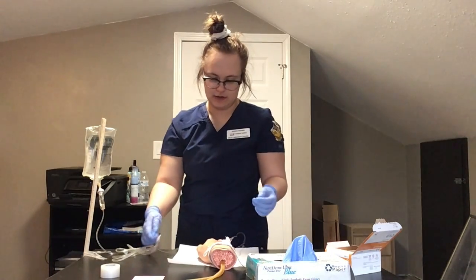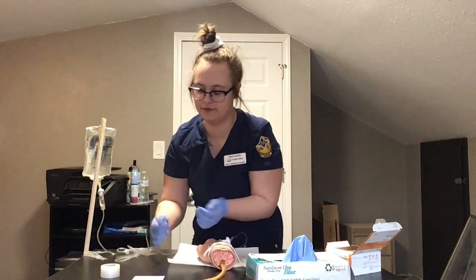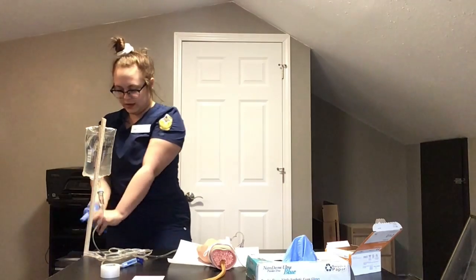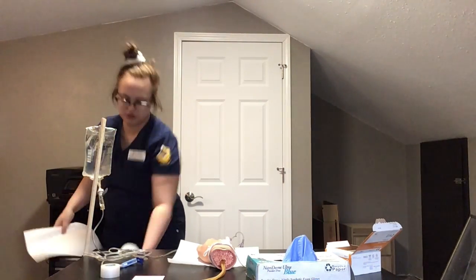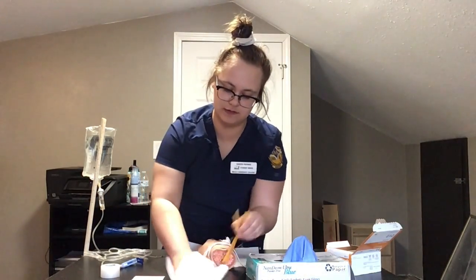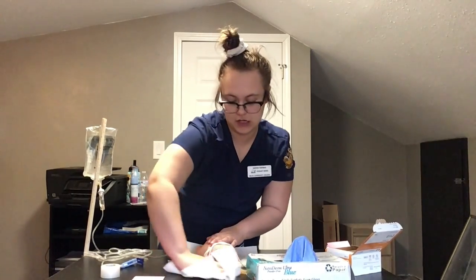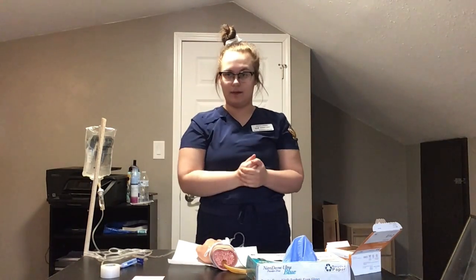Okay. It's infusing. You can see it's leaking out right here. I don't know if you can see that, but it is. So I'm going to lock it so that it doesn't leak all over my floor. Just clean this up. Obviously this won't happen for the real patient. Okay. Then, after that's all done, everything is cleaned up, I would perform hand hygiene.